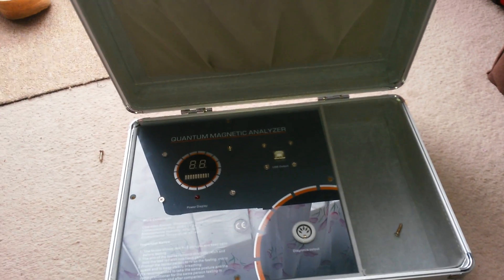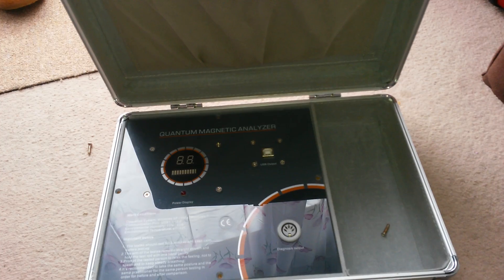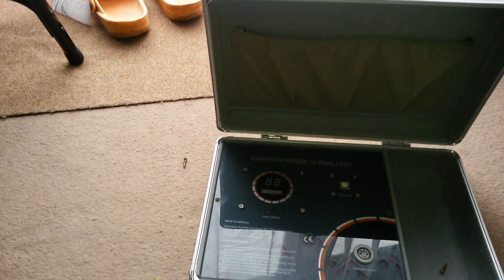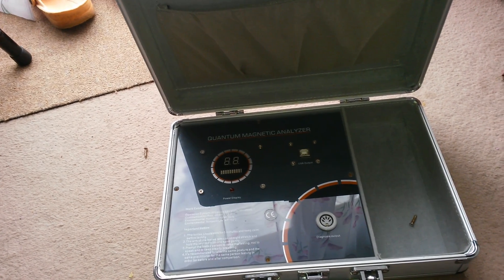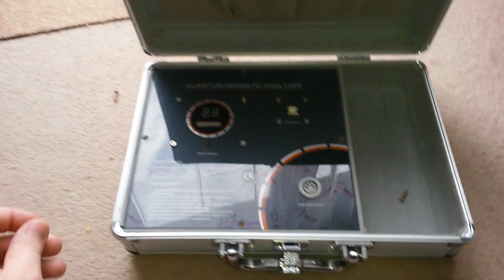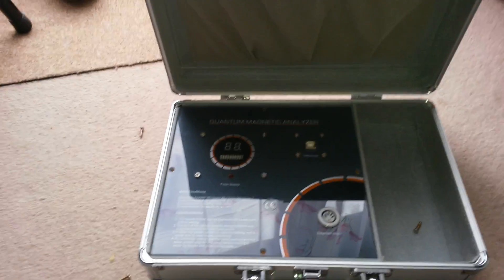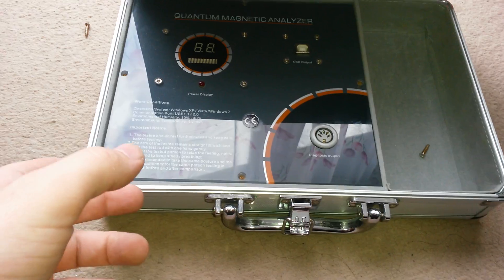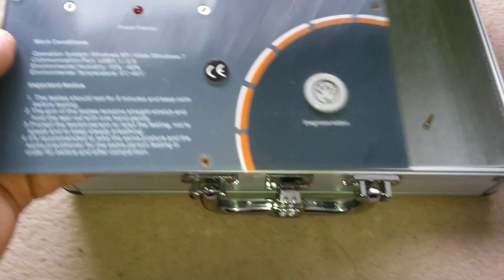I'm gonna show you what the analyzer is, because a lot of people — a lot of doctors — are telling people that it is very perfect. They show you things about whether you have sickness in your lungs, kidneys, or whatever else. So I unscrewed the analyzer and I'm gonna show you what is inside.